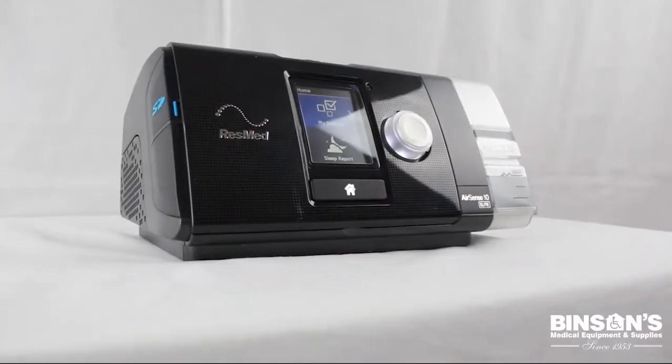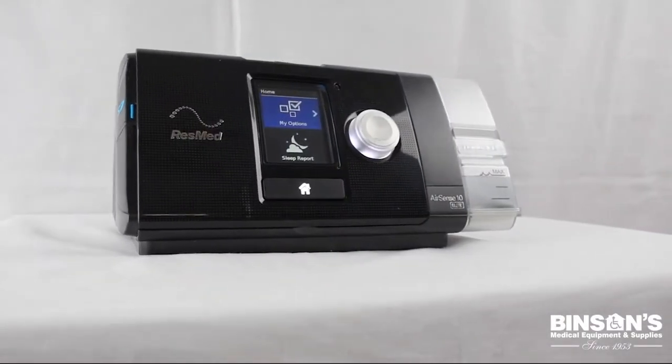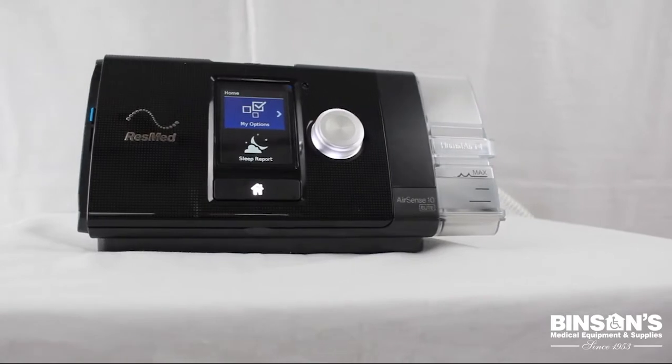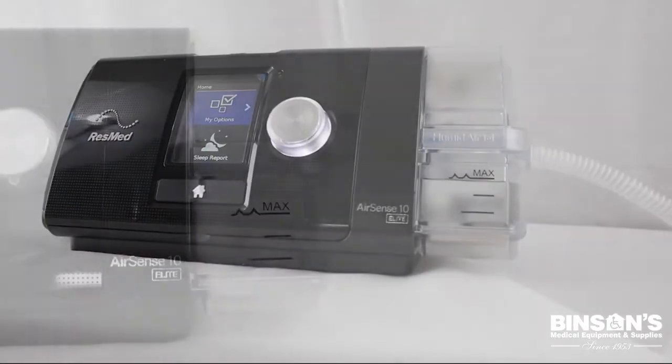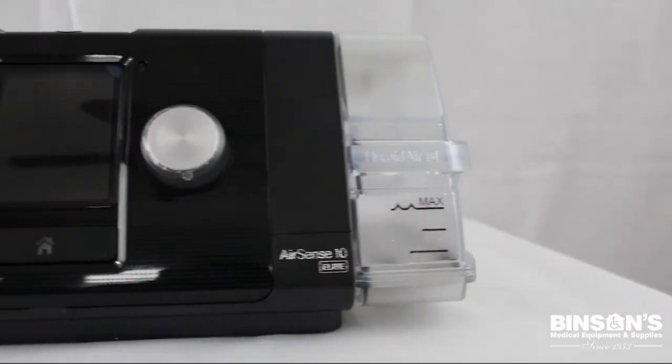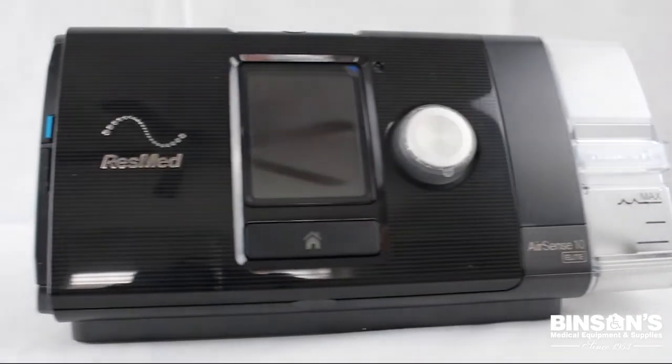This video will explain how to set up your ResMed AirSense 10 and get it ready for use. Your machine will arrive preset to your prescribed pressure. We will also briefly cover how the ResMed AirSense 10 works.